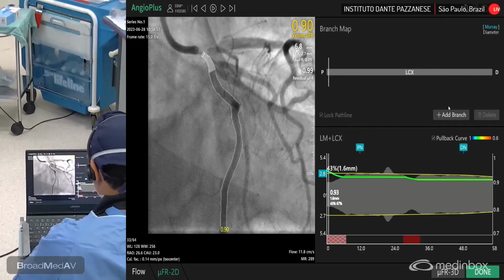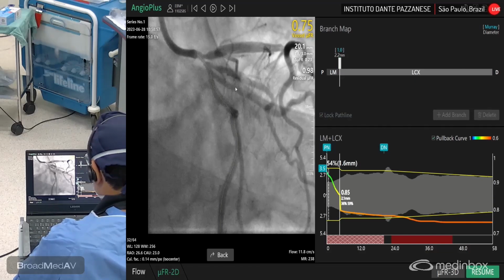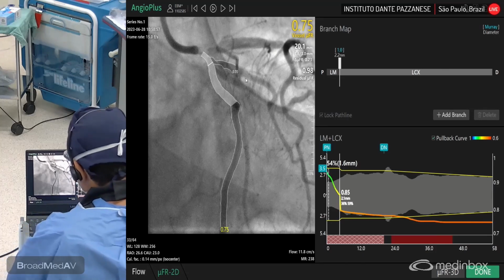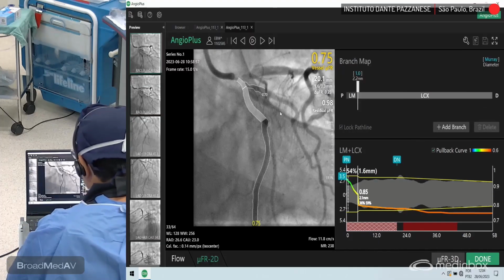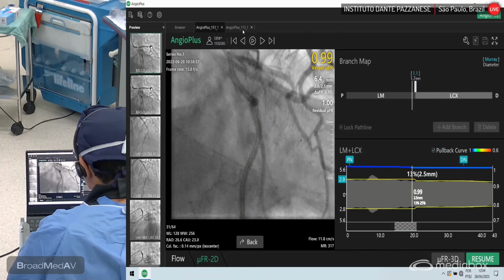So Louis, where are you now? You're doing the pre, right? Yes, I'm doing the pre, which was significant, as we mentioned. Okay, so basically doing again, and you want to do the final, right? Yes, this is 0.7. I'm trying to add the branch here. And I remember you did some editing, and then we had the final analysis.